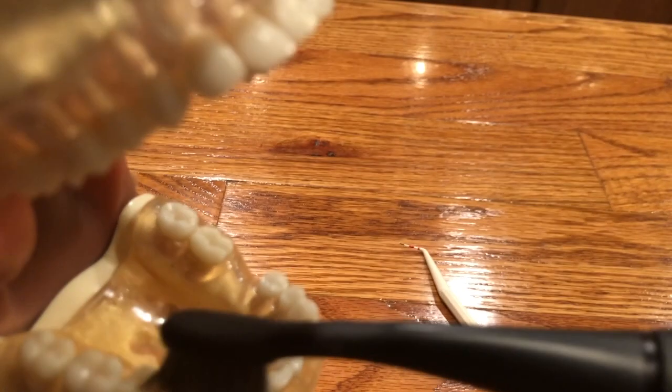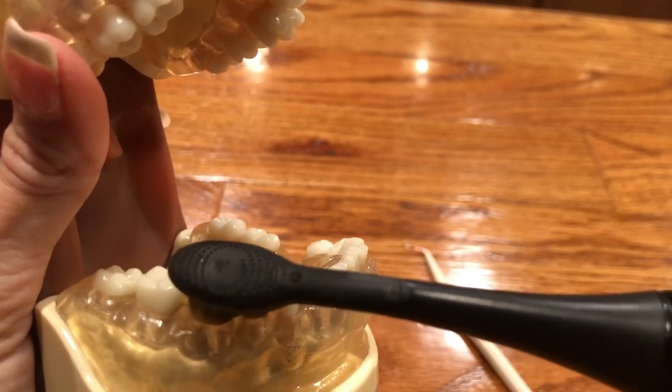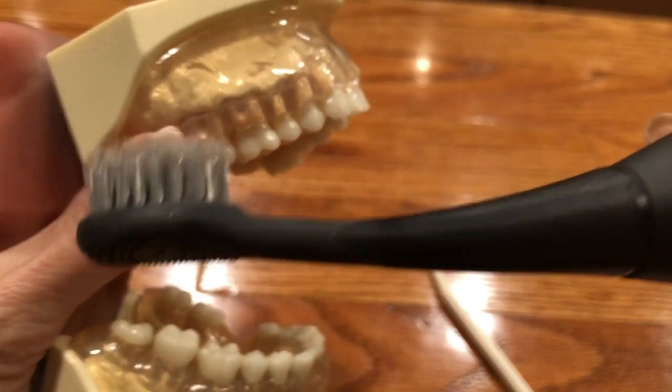So you want to make sure that you're not just brushing this fast, because you can see you're not giving the toothbrush time to get down below the gum line there. So you want to take your time and let it go around. So depending on how many teeth you have and the disease in your mouth, you can see it shuts off after 2 minutes.